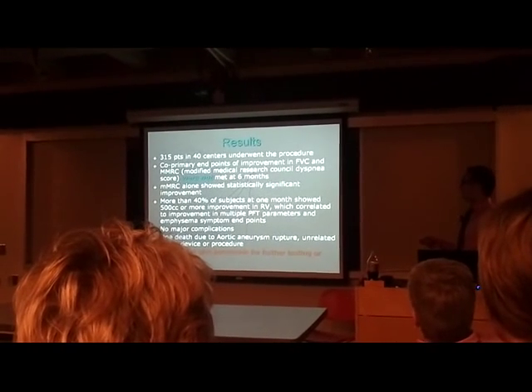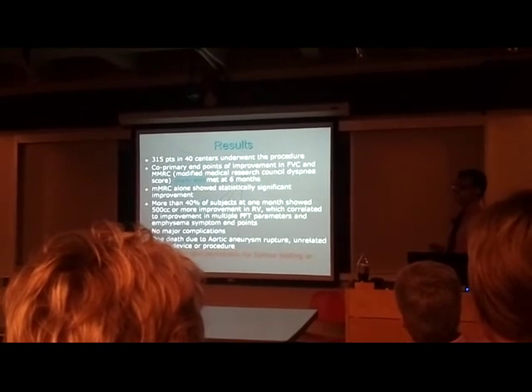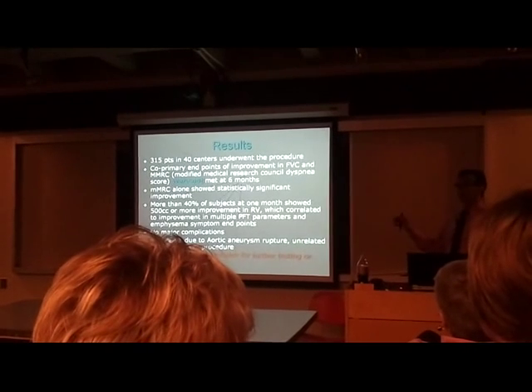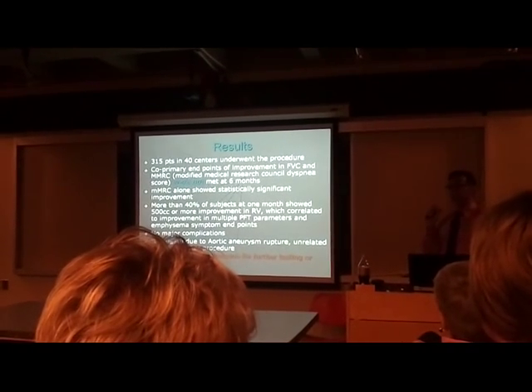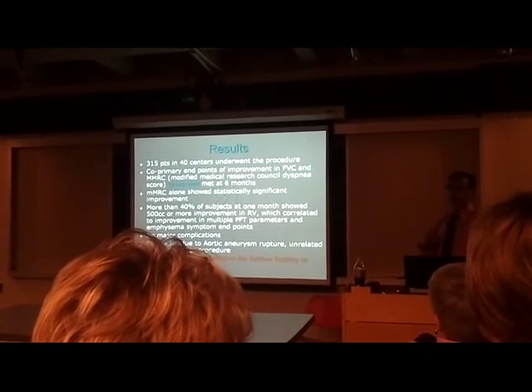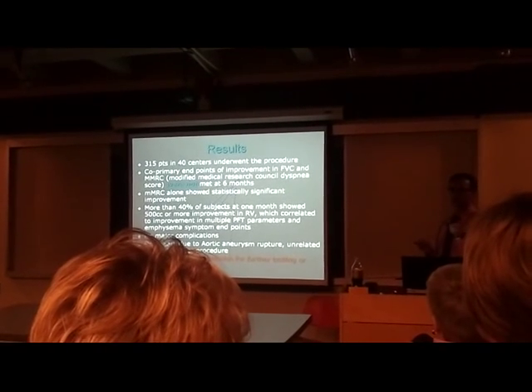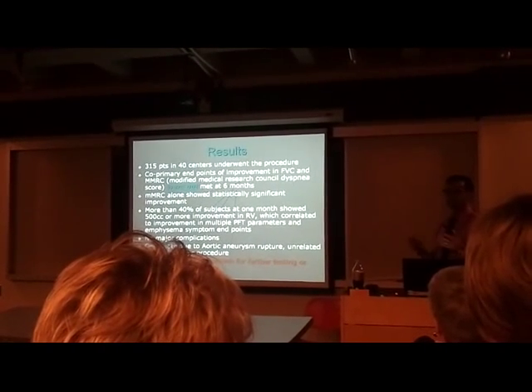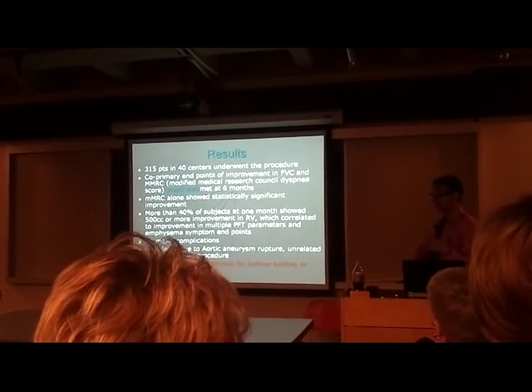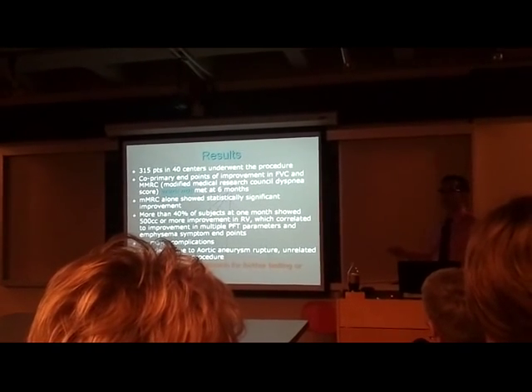And from my personal experience of doing several patients of these, most of them had benefit in the first month or so. Despite all our efforts to have the drug-eluting valves, most of the valves got closed by tiny mucus plugs, or they were coughed out. I had at least 2 patients who came in with little tiny things in their hands. So I told them to just put it into a tiny Ziploc and bring it to us so we could keep count of those. Because we would sometimes put 12 or 14 or 16 holes and valves in there.